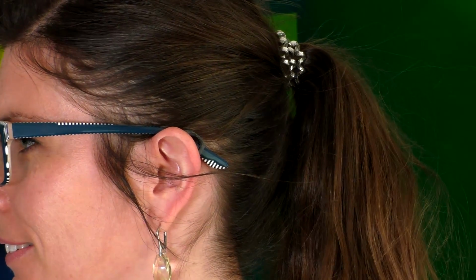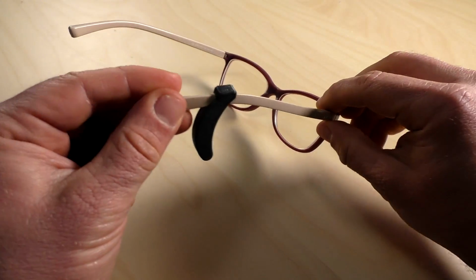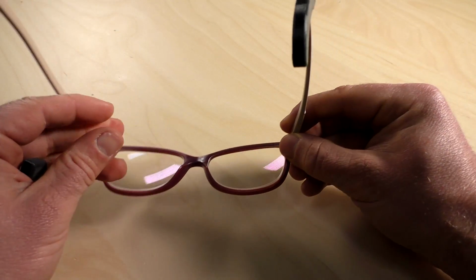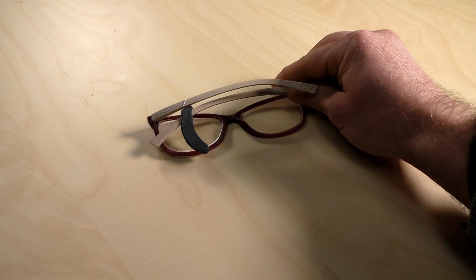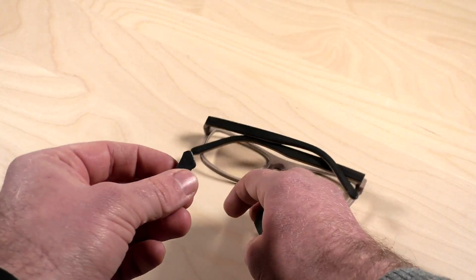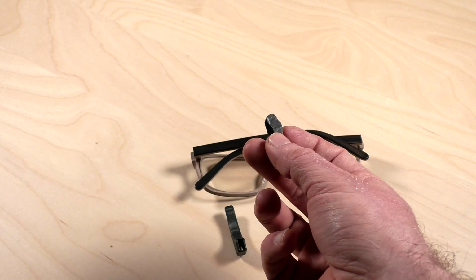I've been testing both models for a few weeks now. This one really holds the glasses in place. In fact, you can use just one and it still works the same. On the downside, it's harder to put glasses on or off, and my ears hurt a bit at the end of the day, as it's quite thick. So I went back and designed a better version, which doesn't put so much stress on your ears. This one works much better.